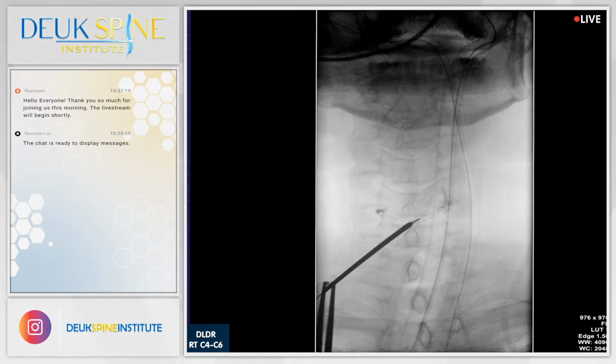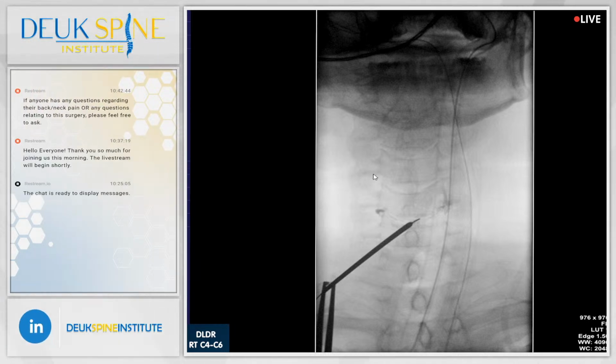You can see the spinous process. Show us the spinous process above and below. You can see the dye. Show us the spinous process. Can you guys see the arrow? Yes, we do. There and there. And if you draw a line between the two, that's right where the tip of the dilator is. That means it's in the middle of the front of the spine.